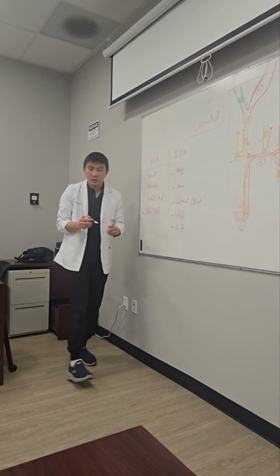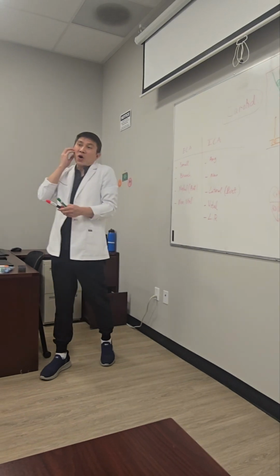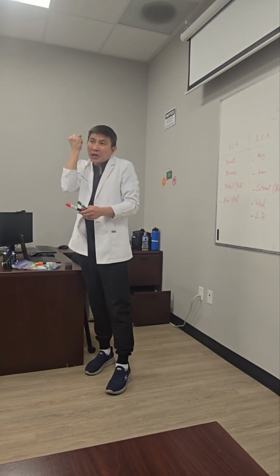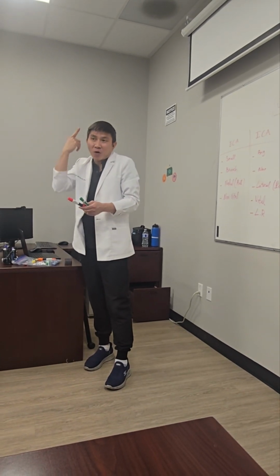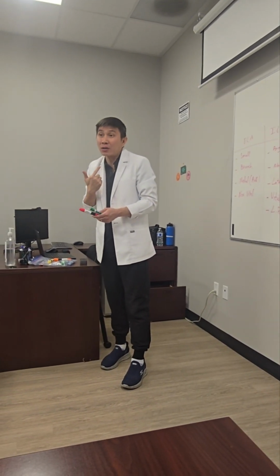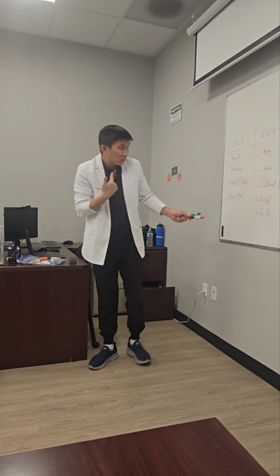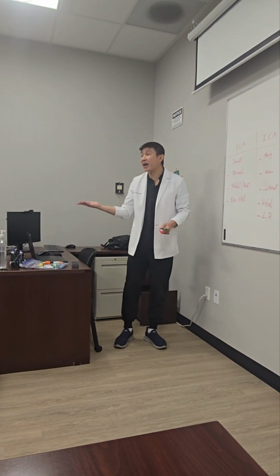The opposite is the skin. Oh, it's too cold, so I don't need you. All the vessels will wrinkle and the blood goes back deep inside, to spare for some more important structure at that time, right? So what is the resistance for the ECA? High resistance.